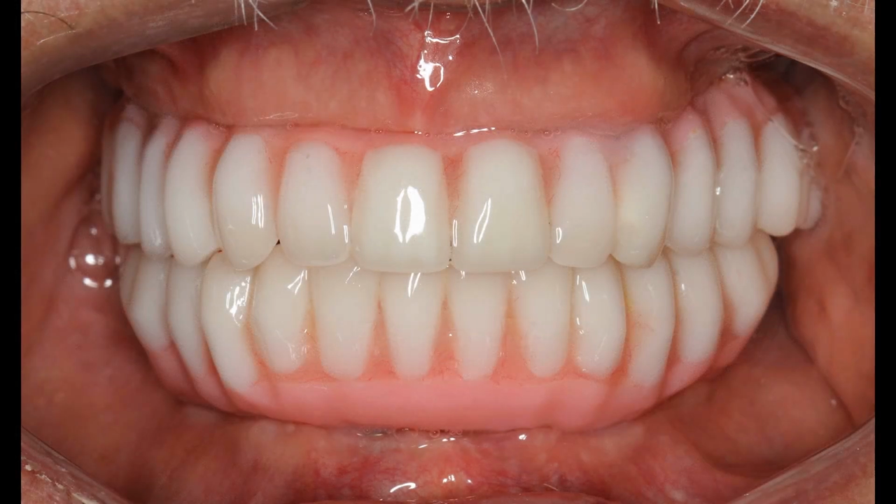And in a case like this, we took his old denture and modified it, but the tissue portion of these temporaries I didn't show you because we didn't photograph them. 3 million photographs in 36 years, and we occasionally miss a few here and there. So these served as his temporary, but the way I did my incisions on the day that we gave him these teeth facilitated more good tissue building that you'll see at the very end. I can't give away all my secrets.